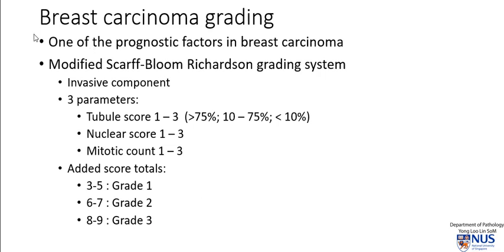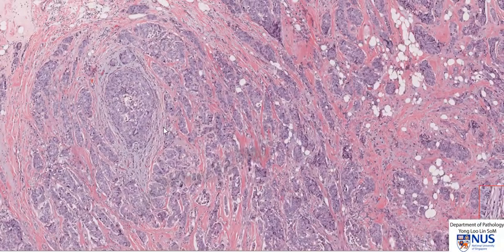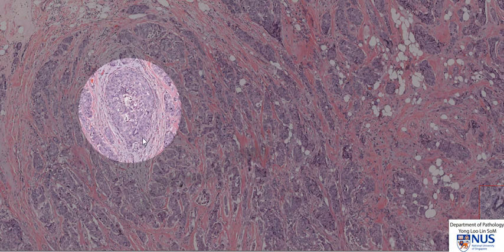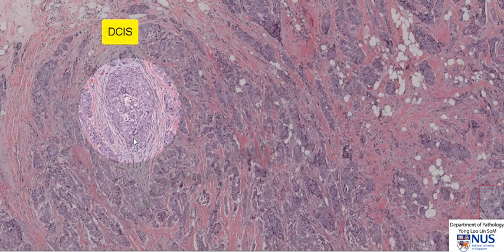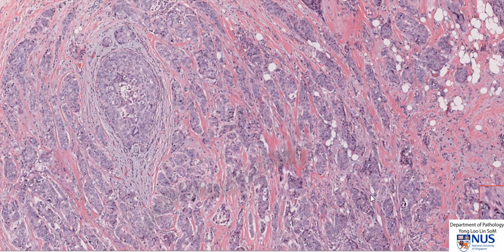Now let's look at this in real life. Here is a case of invasive ductal carcinoma. If you look carefully, you'll see there is actually a focus of DCIS, or ductal carcinoma in situ. I'm not going to use this for my grading — I will only grade the invasive components.